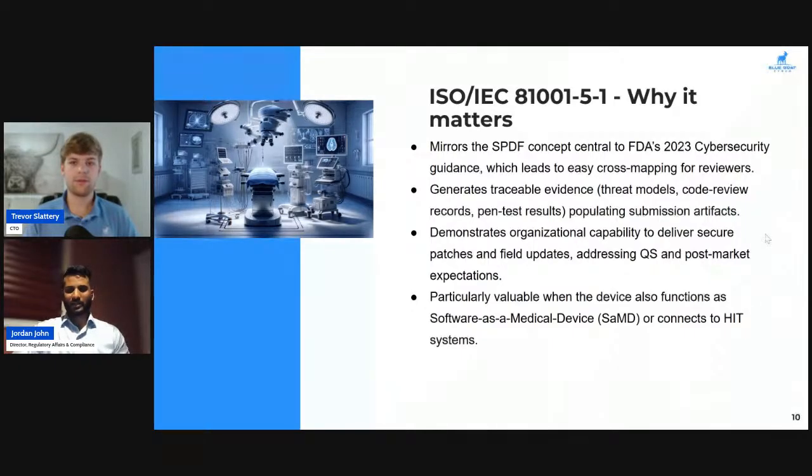Yeah, I guess it all comes back down to risk management, right? So the standard is especially meant for software as a medical device and any kind of connected device teams, as you mentioned. And it's different than 62304, right? Because it's definitely focused on slightly different things, not just the whole high-level software medical device development cycle. It has many different aspects.